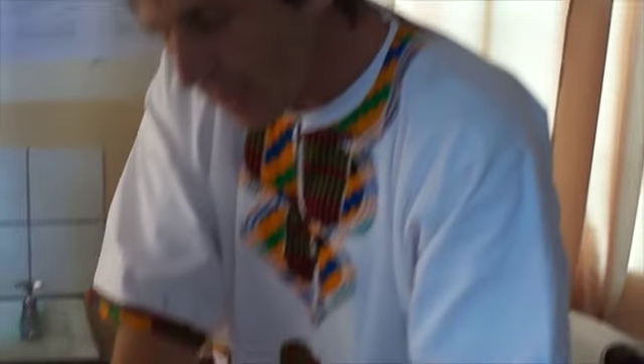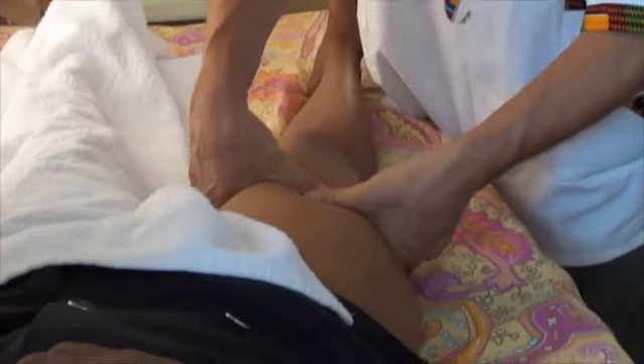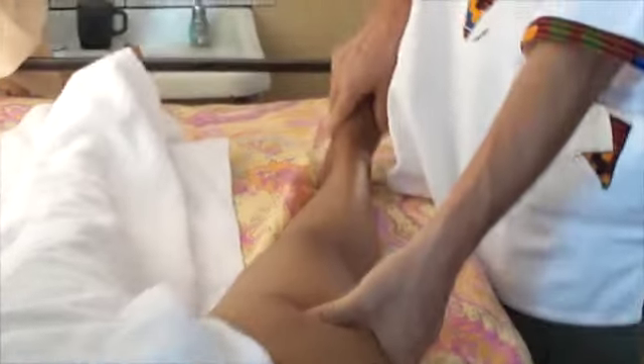It needs practice to do it so that you have more pressure down, and as you come up, the pressure is easing off — not too much, but a little bit, so the push is upward. We should never strangle up here, otherwise the edema is increasing. Thank you.